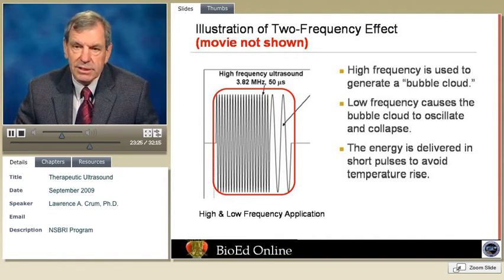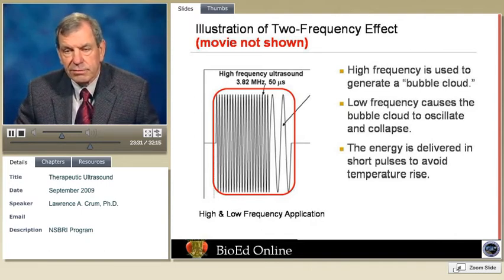I think this is a remarkable example of what a very bright bioengineer can conceive in his own mind and then give his graduate students to demonstrate this technology. It was very impressive. Well, you can see we could use this technology, because it's lightweight and portable, to actually cause stone comminution in space.